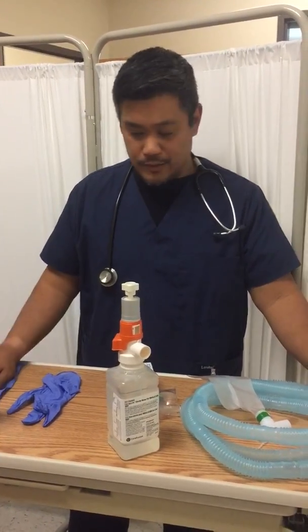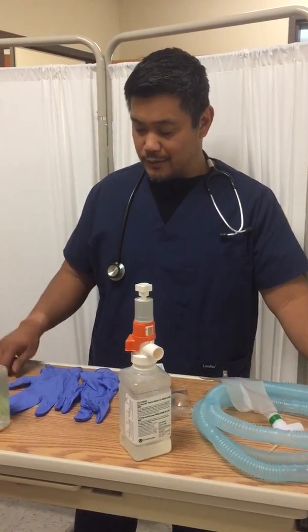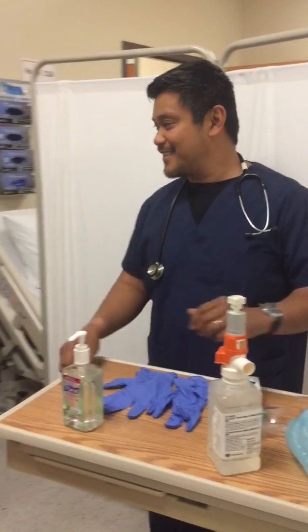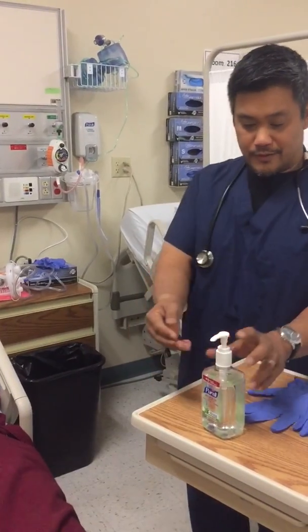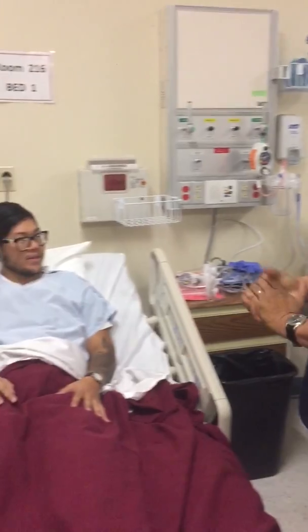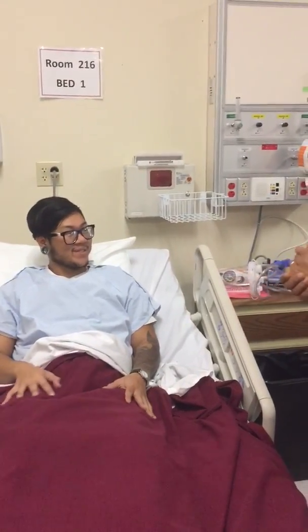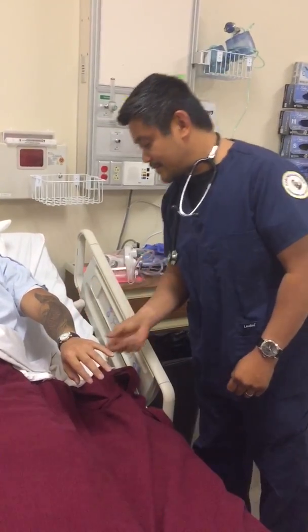So once we get all the equipment set up on our little table, go ahead and knock on the door. Yes. Hi, my name is Richard. I'm a student of the respiratory care program at Hartnell. I'm here to do a treatment for you. First off, may I ask for your name and date of birth? Scott Sixwadi, March 9th, 1992. Right, and with that, check the armband, and that's correct.